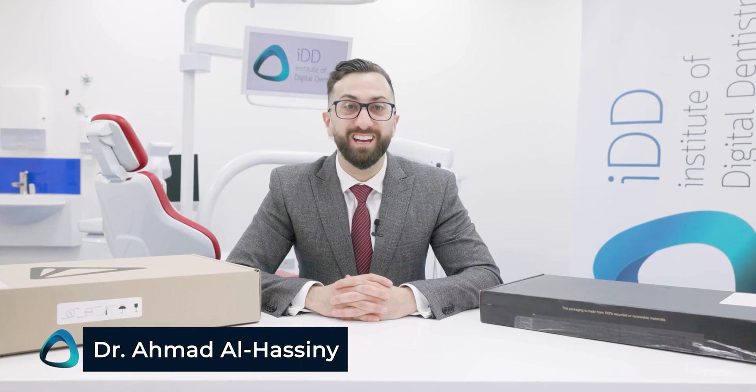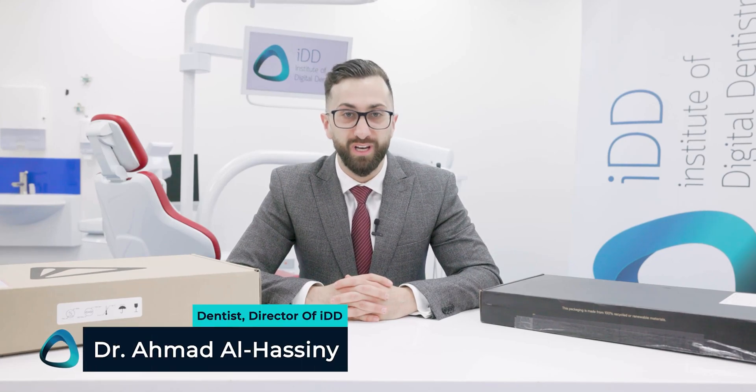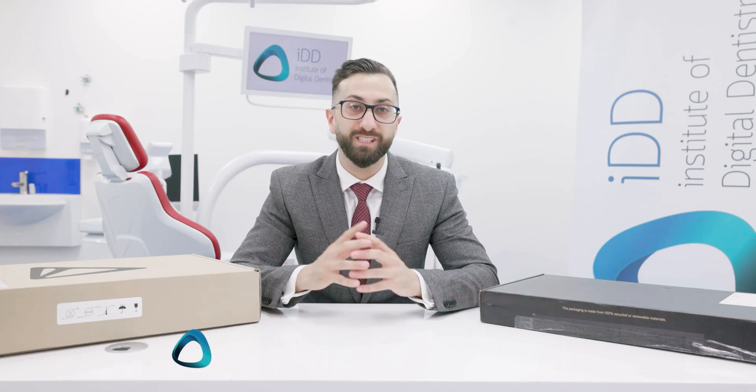Hey everyone, here I have one of the most exciting intraoral scanner releases of 2022. Today we'll be unboxing and discussing the 3Shape Trios 5. This is one of the very first units in New Zealand, which took some time to get here due to the massive demand of the scanner after its launch. The Trios 5 was officially released by 3Shape in their online event in September 2022 — an epic launch event with tons of details about 3Shape's new flagship scanner.